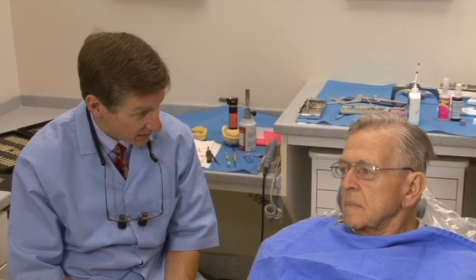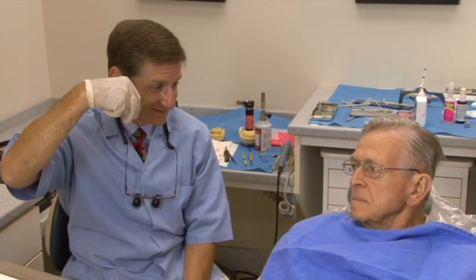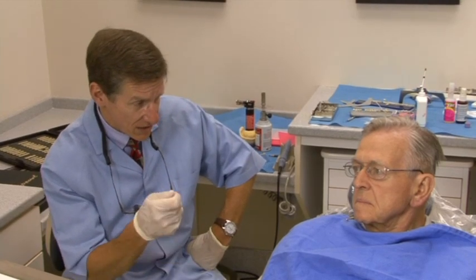If they're just plain sticking out, you do need to move them. If you had to move them for speech reasons, here's how I would move them: only move one side, only move half. A patient can tell you if one side is right or wrong — it's very amazing. By moving one side, you have preserved your mistake and you can get back if you want to. Ask them how it feels. If they say go with it, then move the other side. I was talking to Brantley from the lab and he said just move the two centrals back and we'll correct everything else — going right back to that initial two-teeth set to an S clearance.